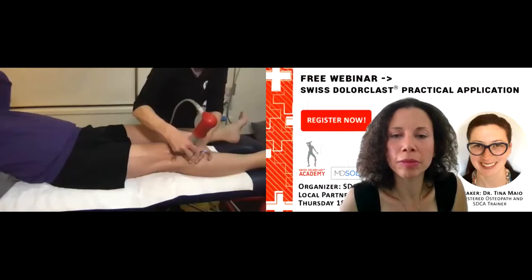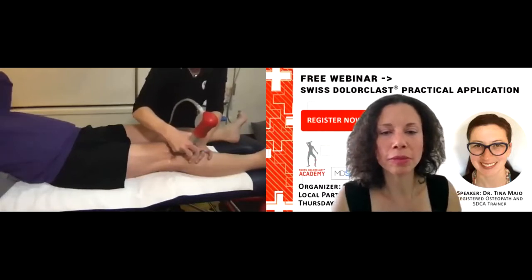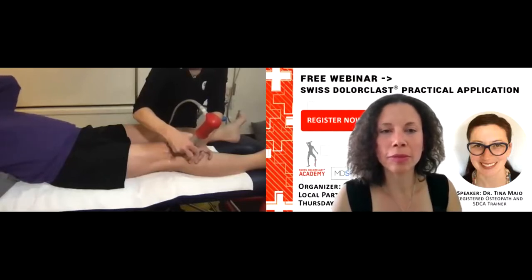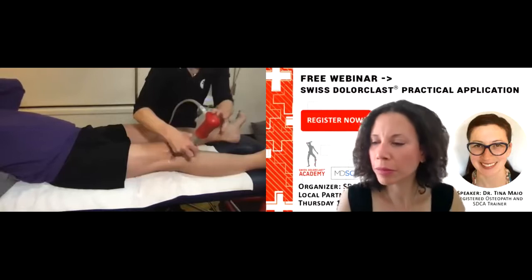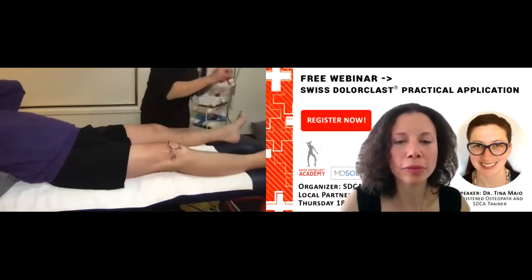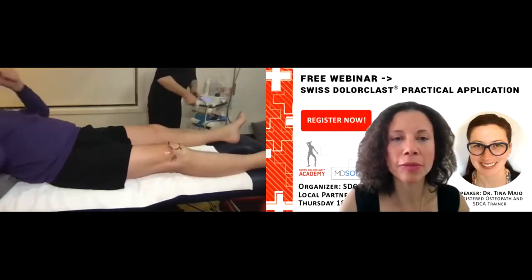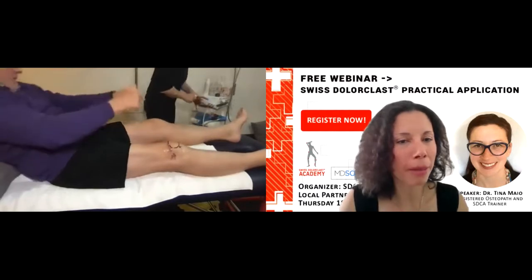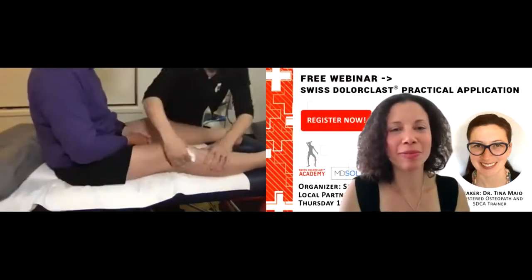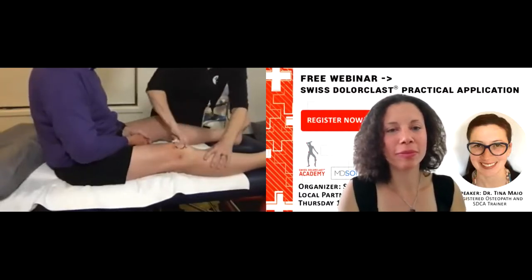So we've got him almost at 3 bars of pressure here. He's doing super well. And we're done. Well done. You okay? Yep. You want a tissue? So just wiping the gel away.